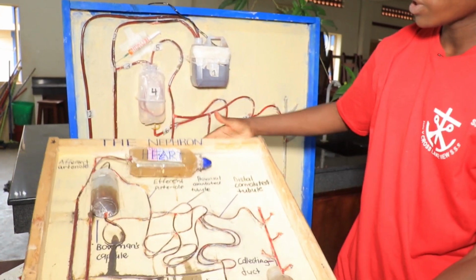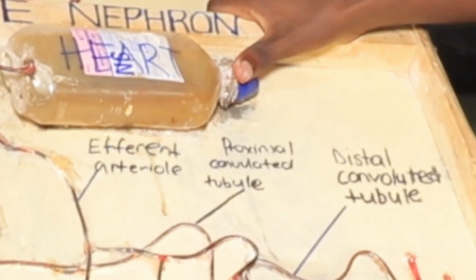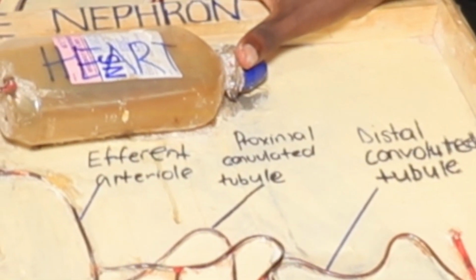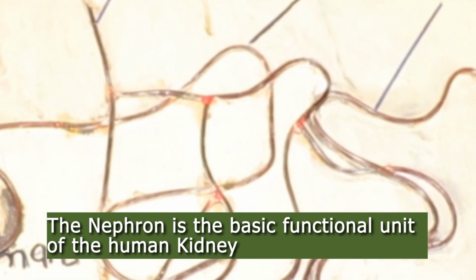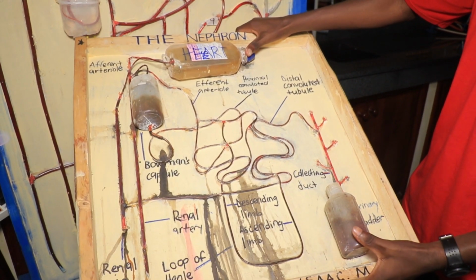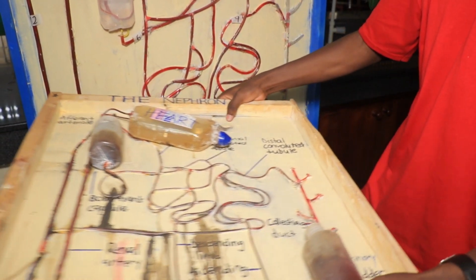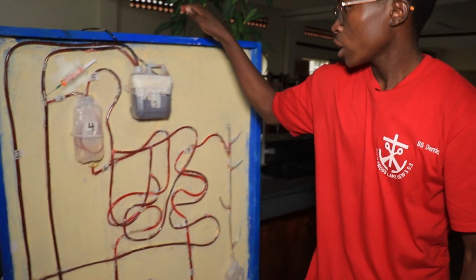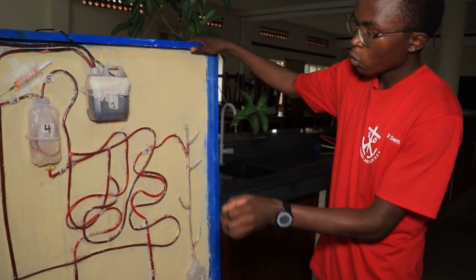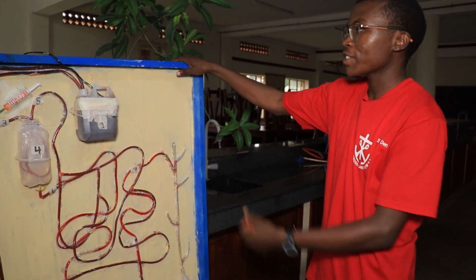We began with the human nephron, showing the structure, and we had a view of upgrading this structure to a real dialysis machine. As you can see, we talked about all the basic science within the nephron and how it performs its work. Then after that, we headed on to developing stage 2 of our dialysis machine.